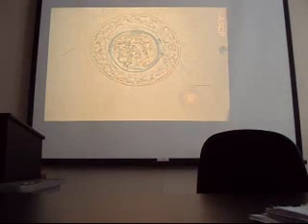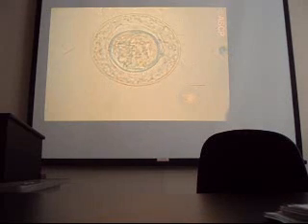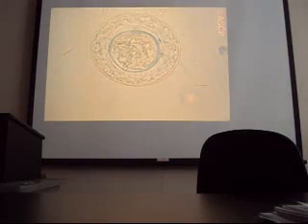Hymenolepis nana, very thin shell. Here's the embryo, and then right here, and also right here, are little strings coming off, little polar filaments. Nana has polar filaments.